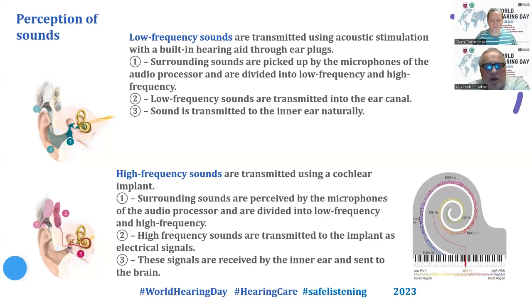So we discuss this, I think, implant system which allows to hear sounds on different levels of frequency, because it is very difficult to hear high frequency sounds in comparison to lower frequency sounds. So high frequency sounds are transmitted using the cochlear implant, as you can see.